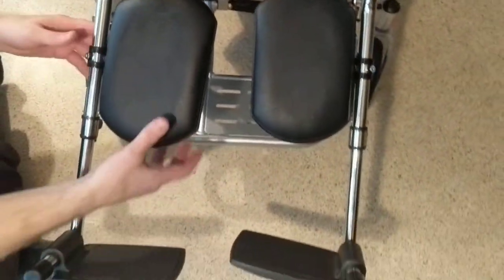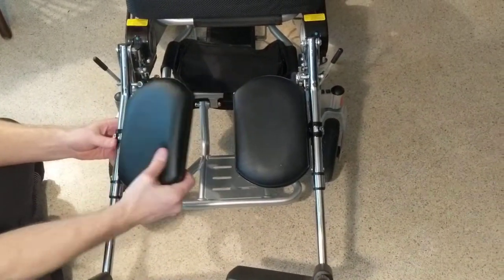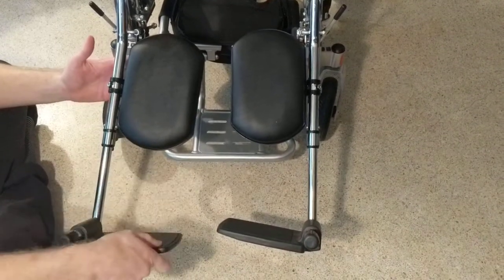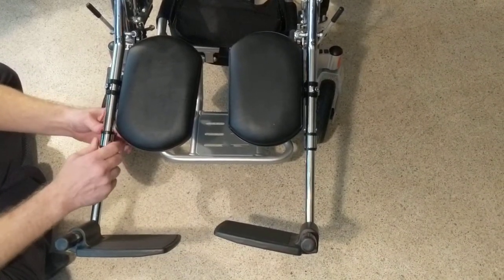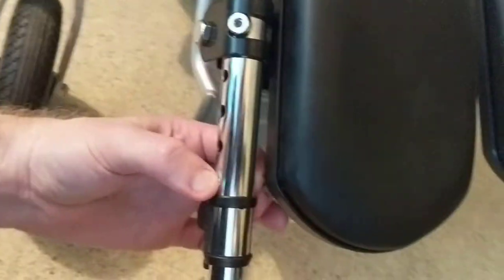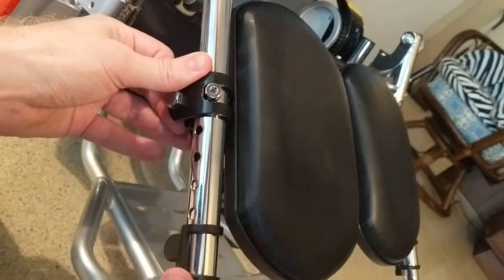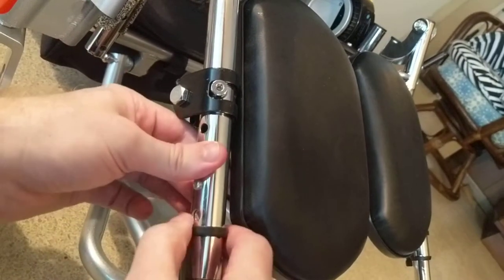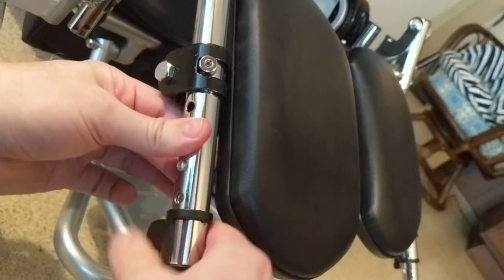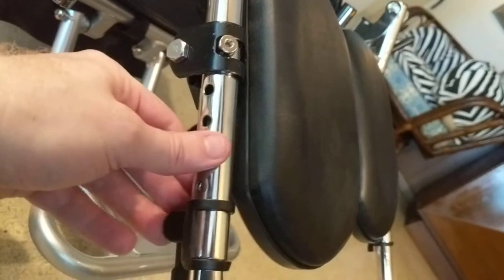Let's take a look at a couple of the other features of the leg lifts themselves. This pad folds up and gets out of the way if need be, and this pad folds up and gets out of the way as well. Looking at the bottom and side of the leg rest, we have an apparatus that allows you to shorten or lengthen the leg rests.